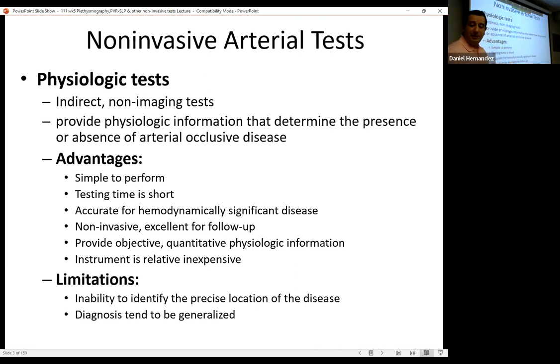But yeah, they do some vascular now, Polydromet. I'm very happy with that. How did you witness this? Yeah, that's fast. That renal, she did a renal study on that guy forever. She had to get the pressures on every single teeny tiny little vessel in the kidney. And my gosh, it almost took 2 hours, because he had all kinds of issues.